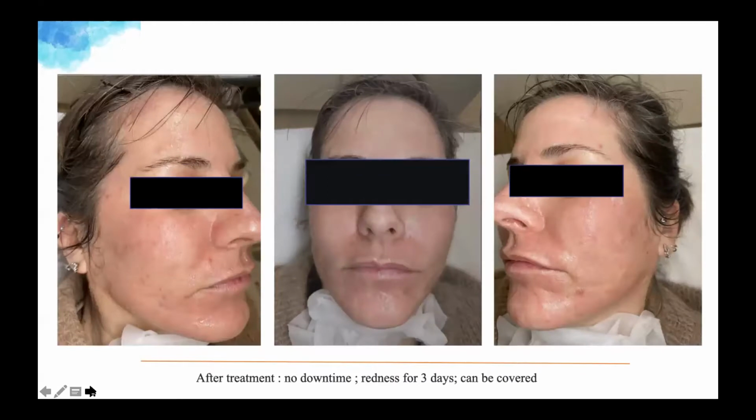Here you can see the picture just after the treatment. So the patient can cover with makeup easily. There is only redness for 3 days, and before each treatment, patient should have a sun blocker to avoid inflammatory hyperpigmentation. So we have to use sun blocker and local anesthesia and moisturizer after treatment.